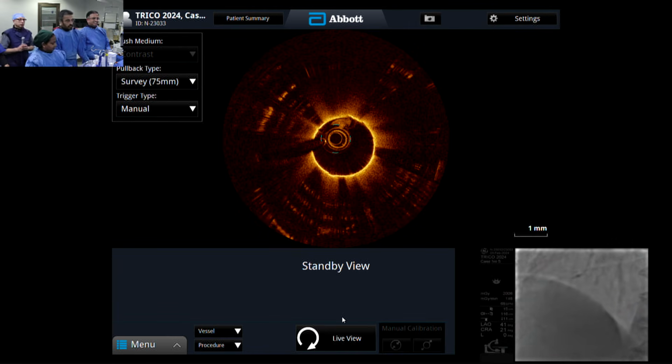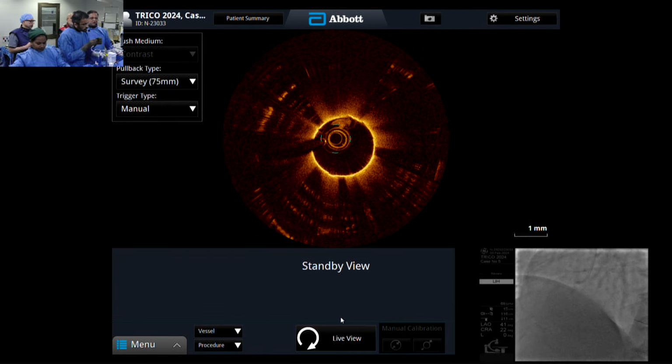Careful. My guide's a little back, so let's take it. All right, we have it. You're off the wire, I think. The OCT is off the wire. We'll have to come out and rewire the OCT. Good, thank you for that reminder. We should have known, but we got too happy about the wire.